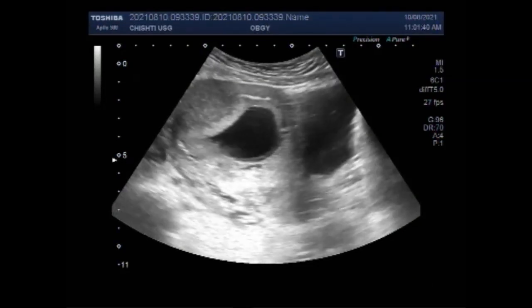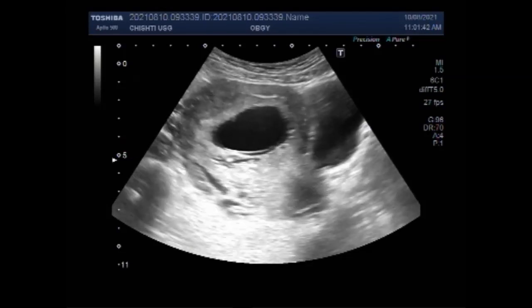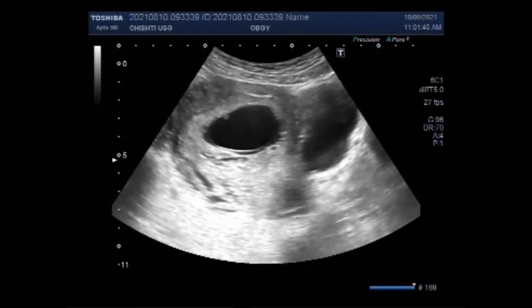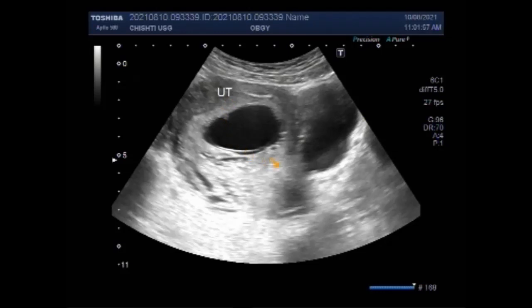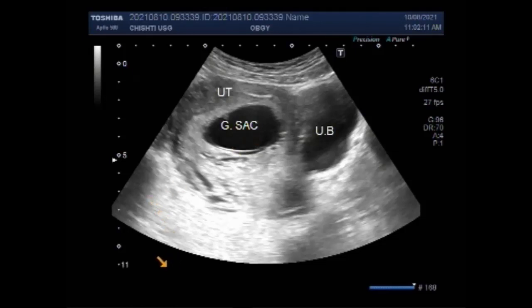Dear viewers, this ultrasound video shows a case of blighted ovum, also known as an anembryonic pregnancy. You can see the uterus having a gestational sac but no fetal pole is visible in its interior. The duration of the pregnancy measures about eight weeks, and as you can see, the gestational sac is empty with no fetal pole visible inside.